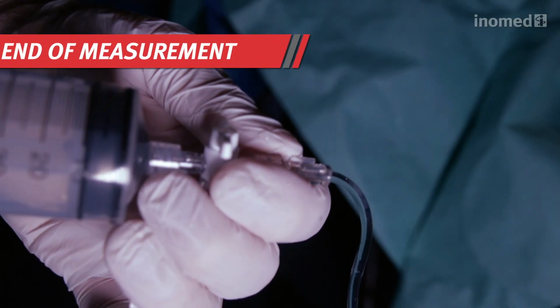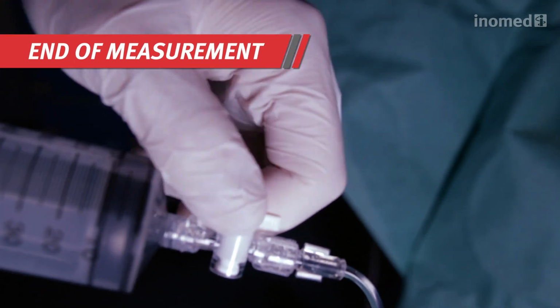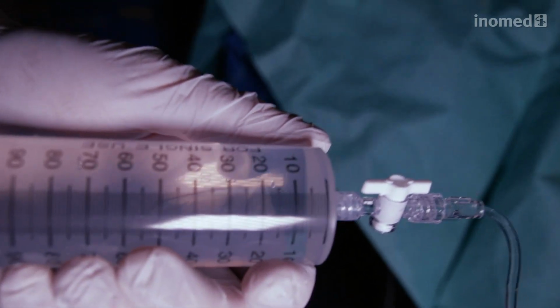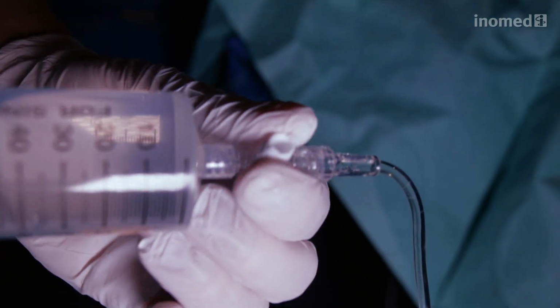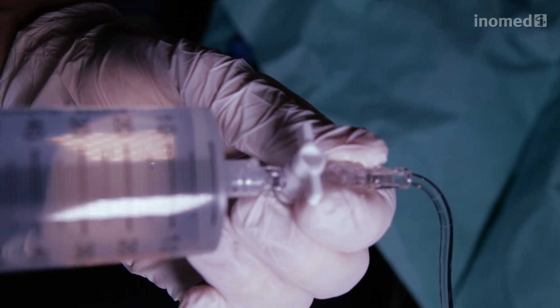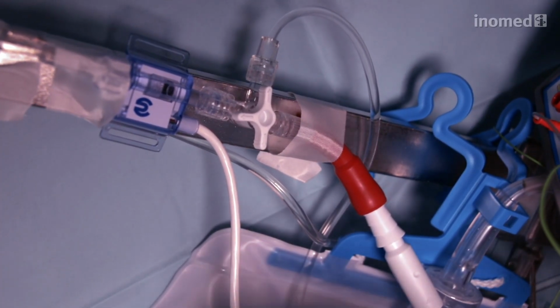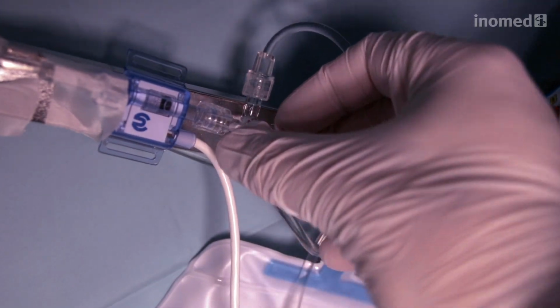After successful and sufficient mapping, the operation can be continued. For this, the bladder is emptied. The solution in the bladder is removed by connecting the syringe and filling it. The last step is to turn the three-way valve back.